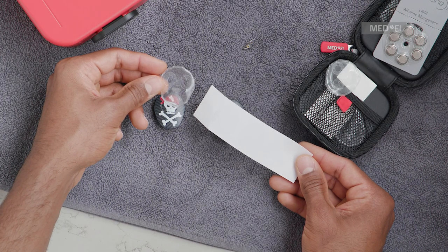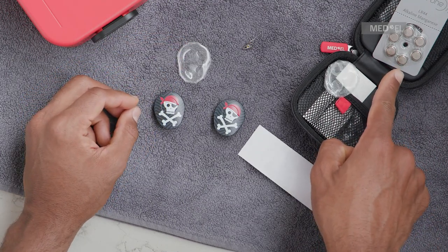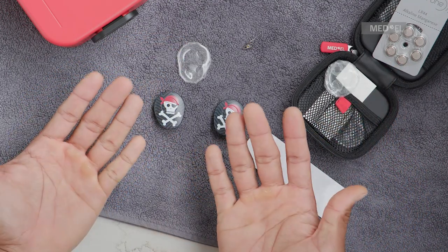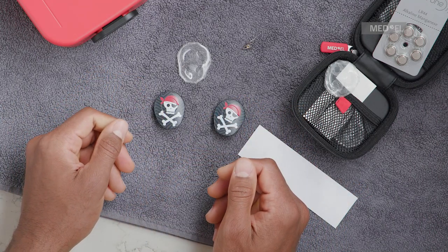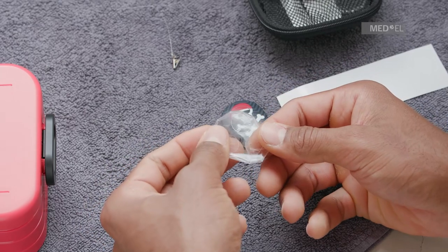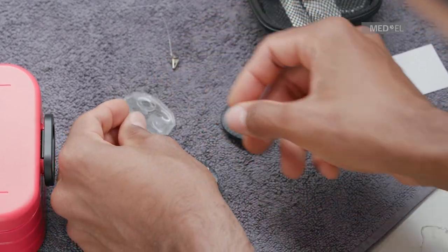Only use alkaline or silver oxide batteries with Waterwear. Make sure your hands are clean and dry before handling Waterwear. Check Waterwear for damage and make sure the inside is clean and dry. Discard Waterwear if it has any damage.